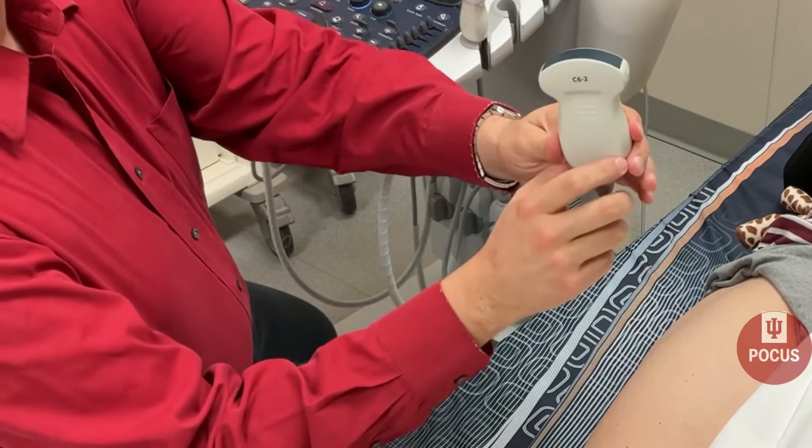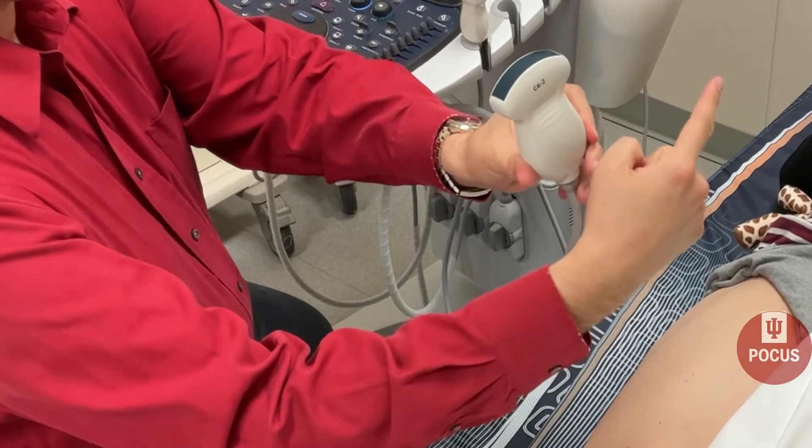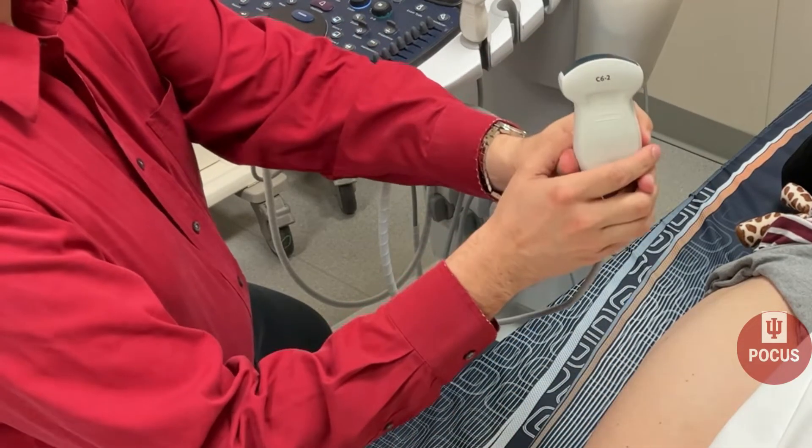Always make sure you make your marker dot point towards the patient's head or right, or whatever structure that you are looking at.